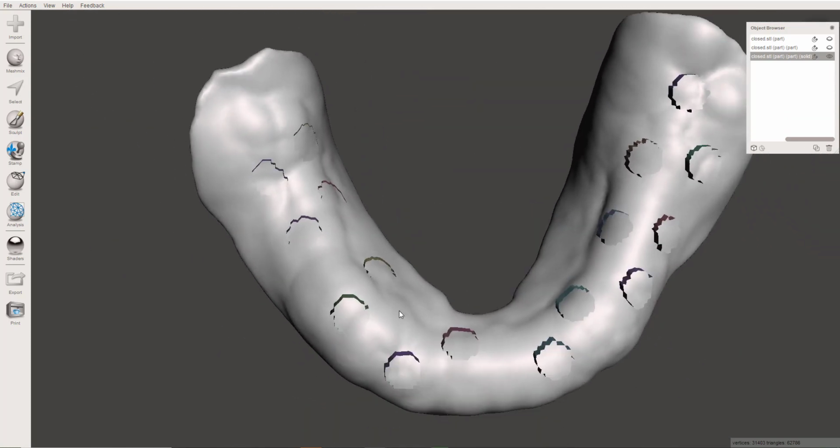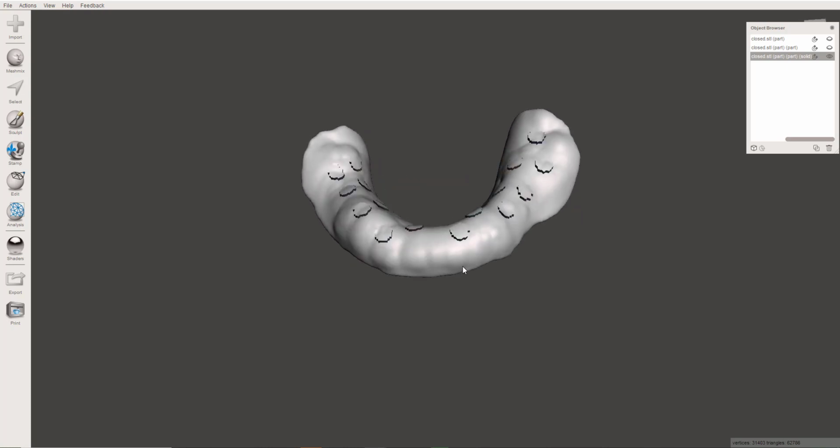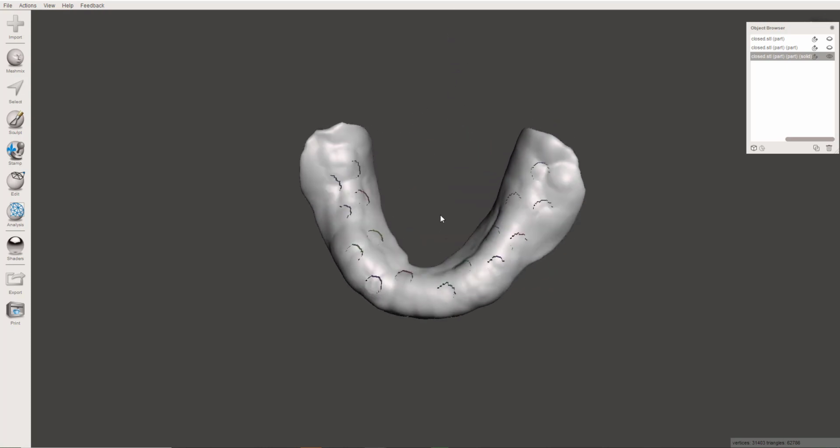And now what you could do is just print this as is, and then go ahead, before you ever get the patient in, take some wax, one piece of base plate wax, roll it up, create a little roll of it, and then just warm it up in a flame and press it down into this. So that's going to do two things. One, it gives you a handle, so during your master impression, you'll be able to hold this extension of wax, the ridge of wax that's sticking up, and be able to hold it down, do your border molding and everything. And then once you've done your impression, the wax is already in place, and so now you can go ahead and proceed with your records.